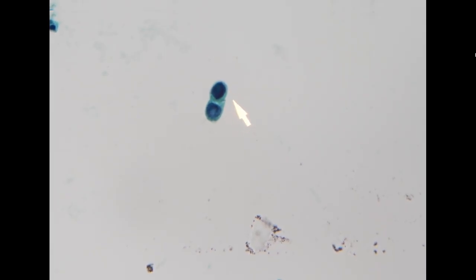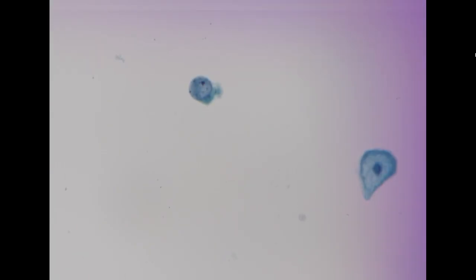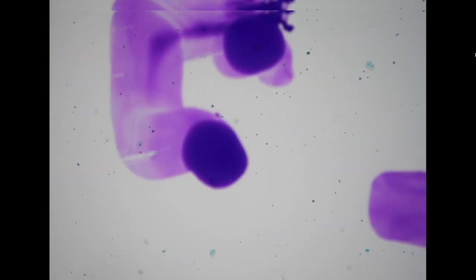It can have darker staining. So these also look like polyoma virus infection. Because of the high NC ratio and hyperchromasia, we call this a decoy cell because it mimics high-grade urothelial carcinoma cells. But due to the patient's history and the cytomorphologic pattern, this is negative for high-grade urothelial carcinoma, but positive for polyoma virus infection. So this is the viral inclusion that you can see in the nucleus.